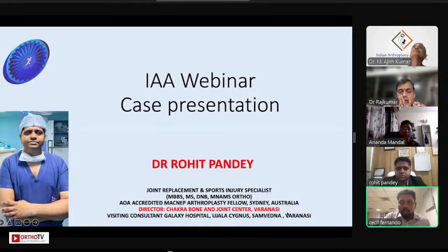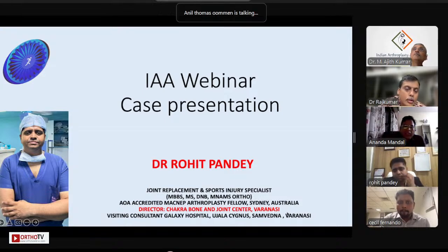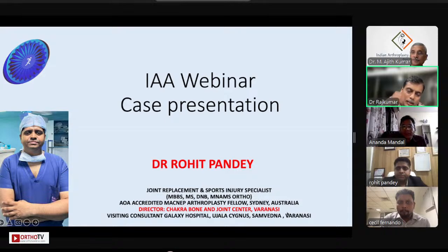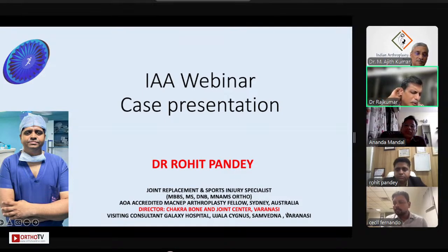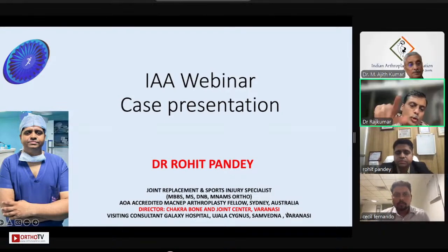So it was a 15 into 140 mm stem. And what is the proximal like? Not the length, the diameter of the proximal segment. Anil, the proximal one comes as small, medium, long. It doesn't have an option to select the thickness. It is only three sizes: small, medium, long. Based on small, medium, long, the length increases. The distal one comes in 140 and then 200.